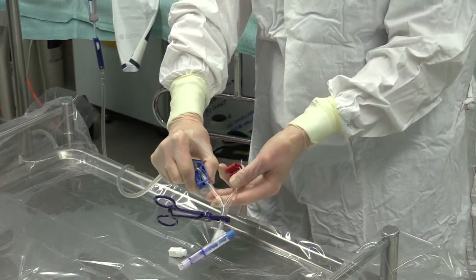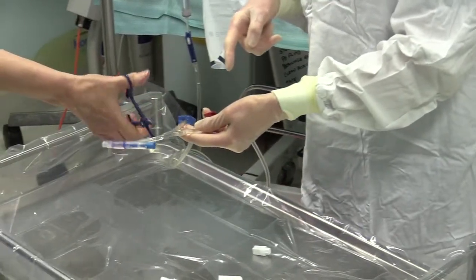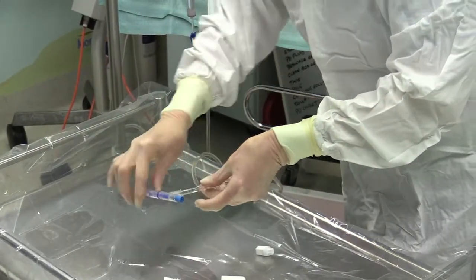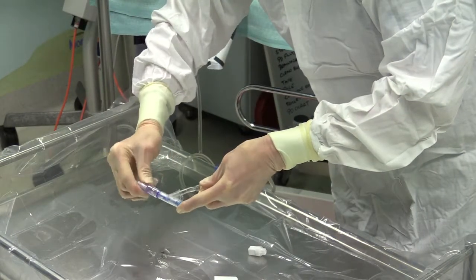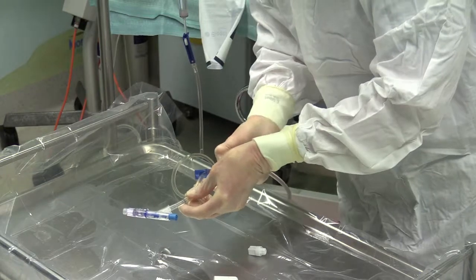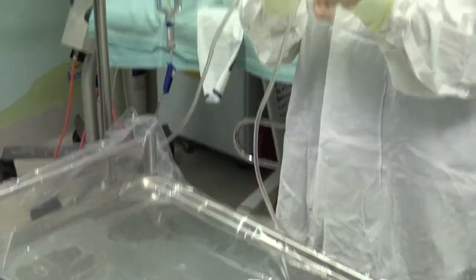clamp the blue clamp. And then my assistant can take over just for the minute, and I'll just clear the end, tighten it again, and it's ready to connect to the patient.